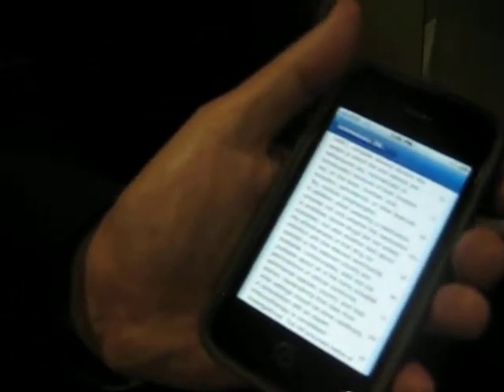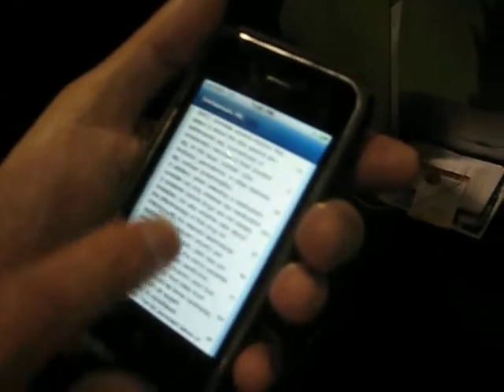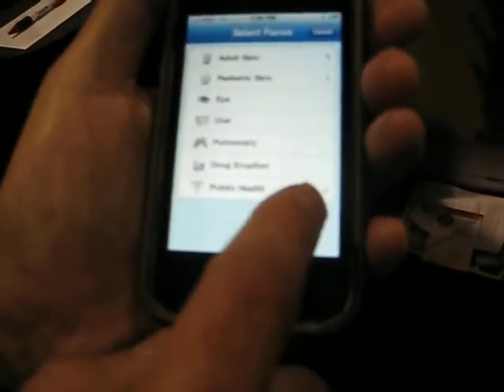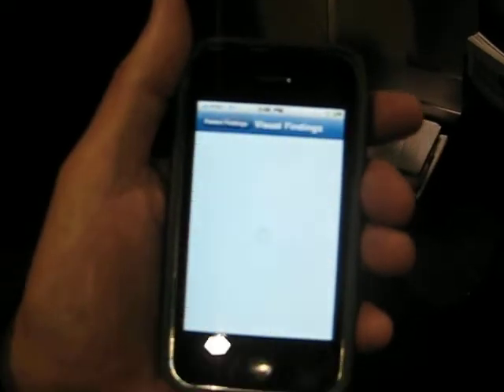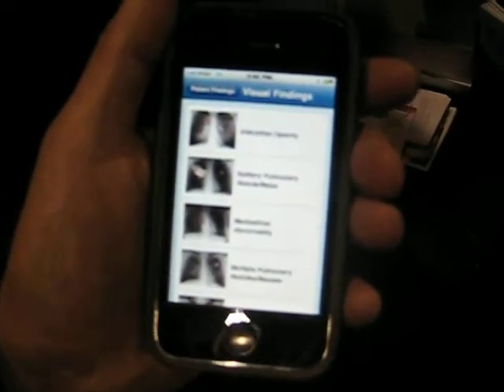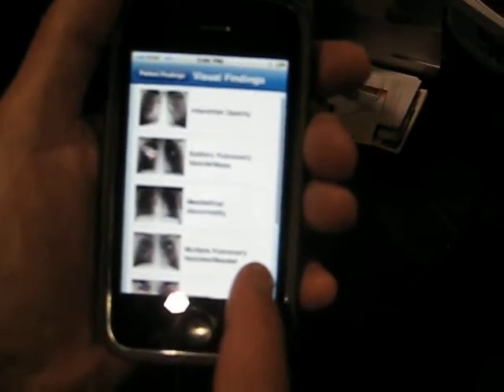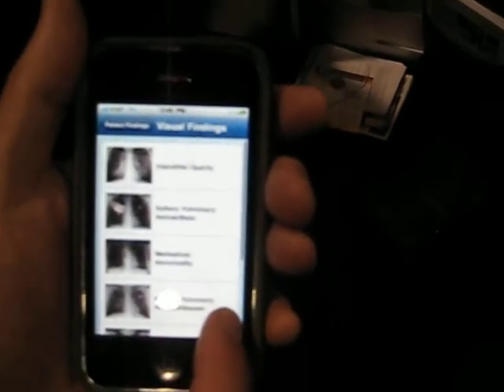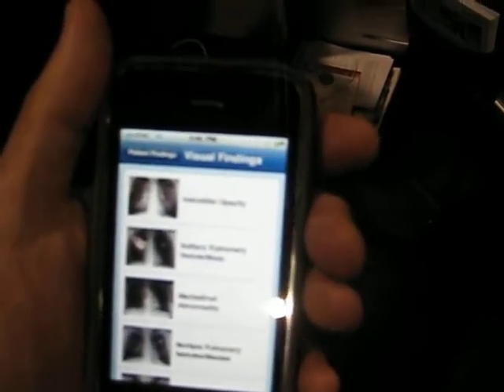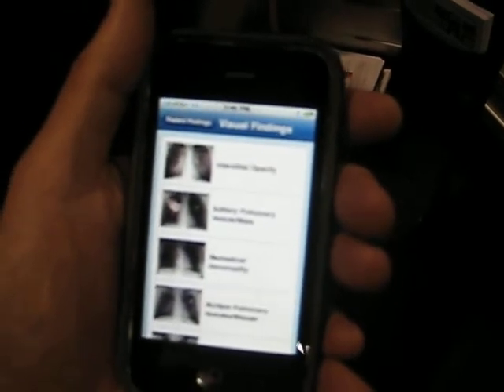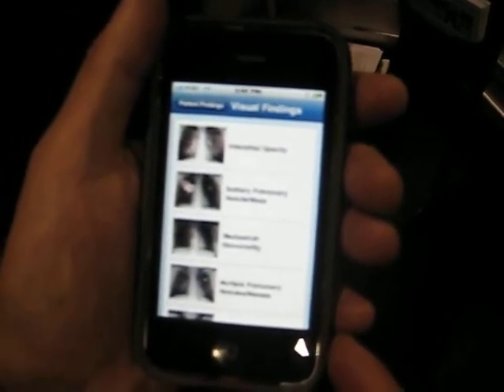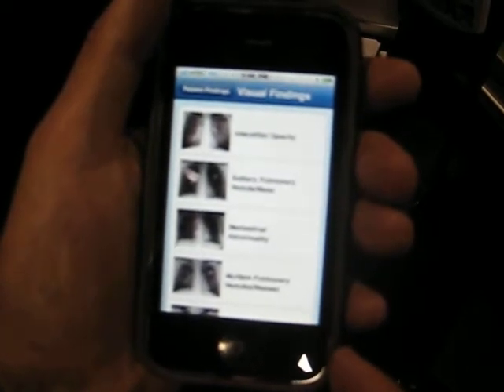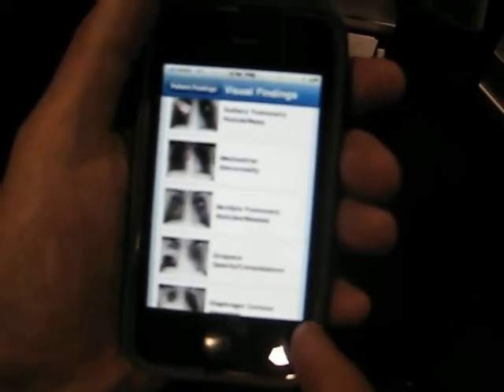On the iPhone, do you have the radiology product? That's even a broader audience. Emergency physicians often don't have a radiologist on staff. We're currently only covering pulmonary infections, and what we do is we show the basic high-level findings you might see. So read some of those headings: interstitial opacity, solitary pulmonary nodules or masses, a mediastinal abnormality, or multiple pulmonary nodules or masses.